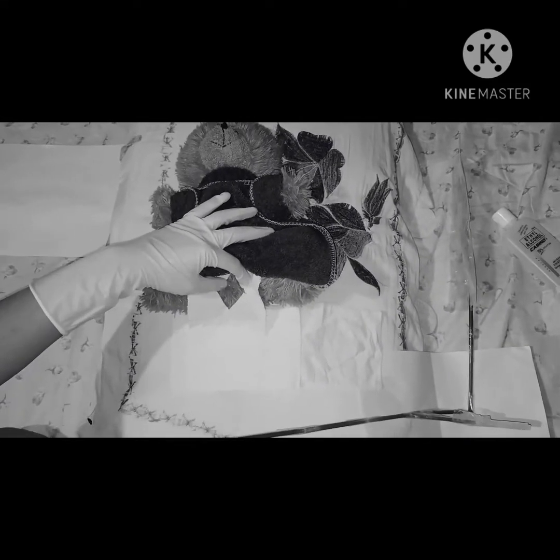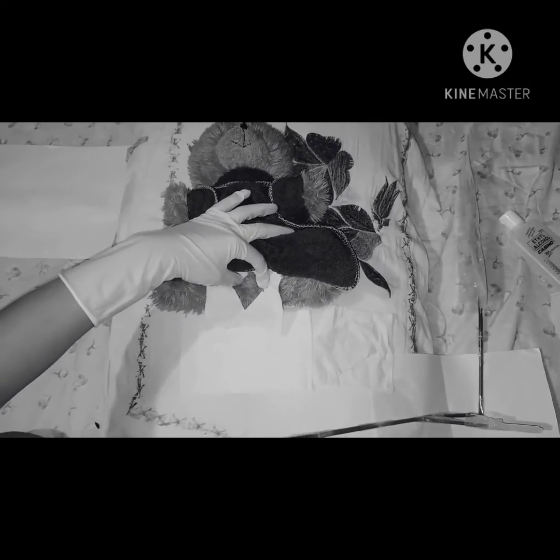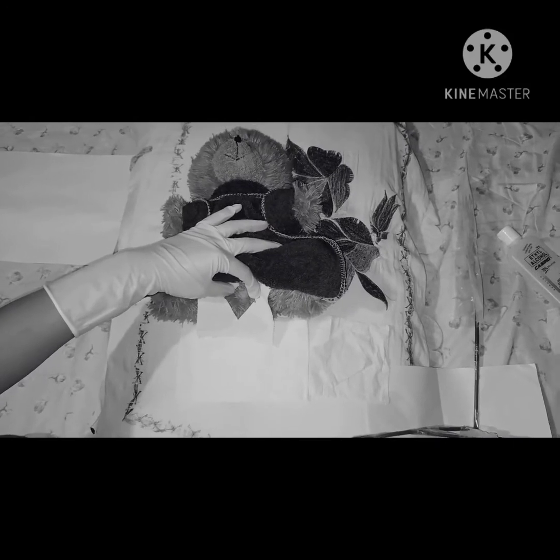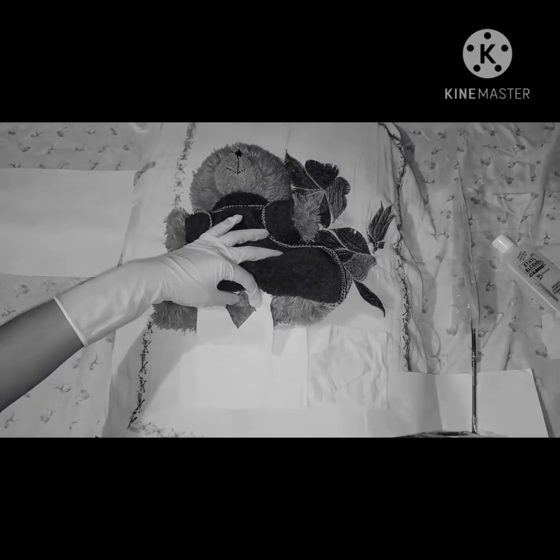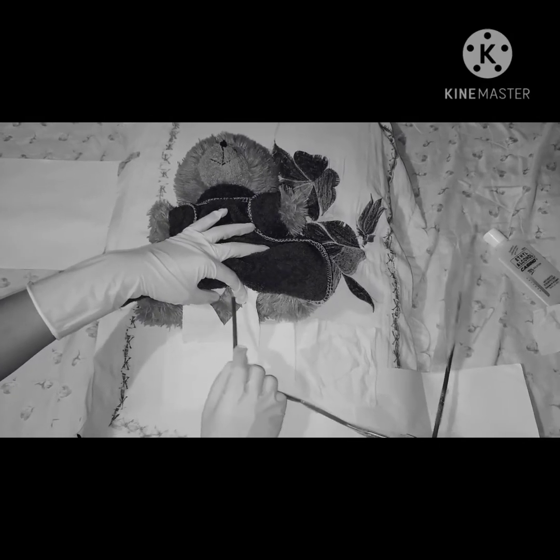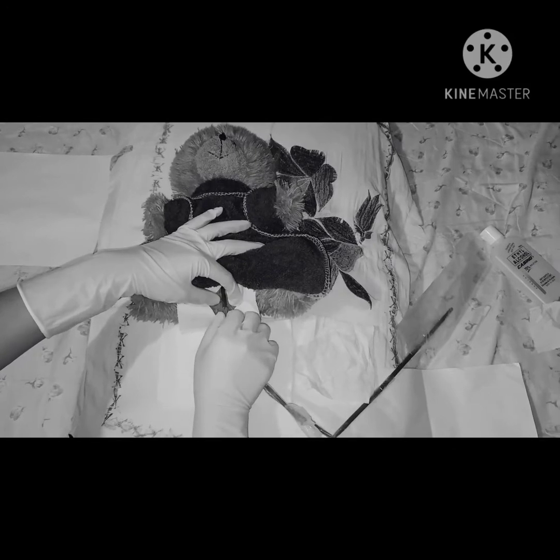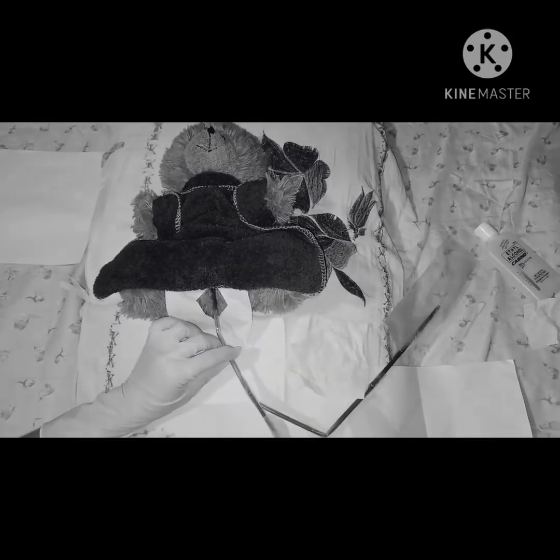Before inserting the urinary catheter, I must assess the urinary meatus, and after I find it, I'm going to ask my patient to take a deep breath. Mrs. Smith, take a deep breath. I'm going to insert the tube. I keep on inserting the tube until I see some urine. And there, I see some urine flowing.